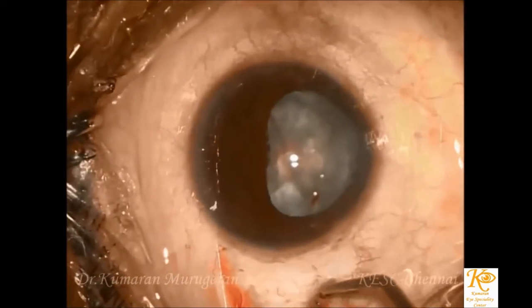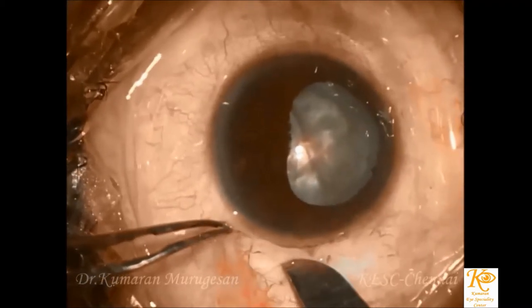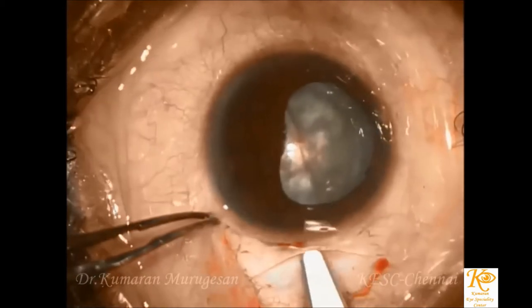This video demonstrates the manual small incision cataract surgery in a case of hypermature cataract with coloboma without the use of capsular tension rings.